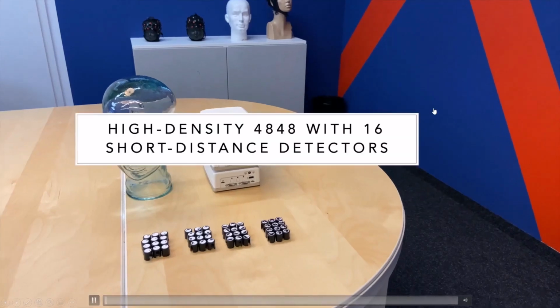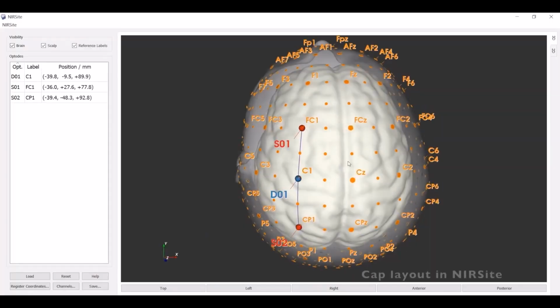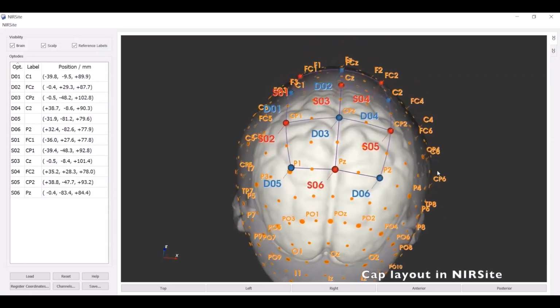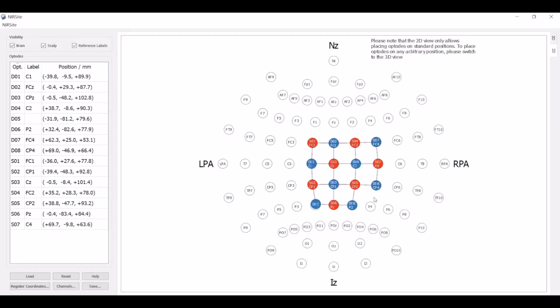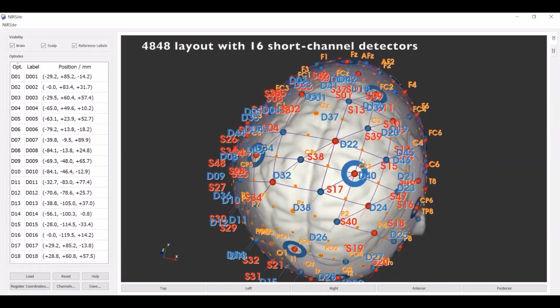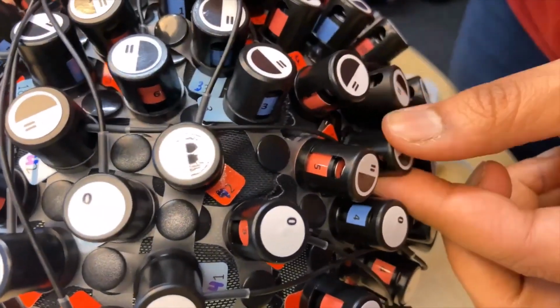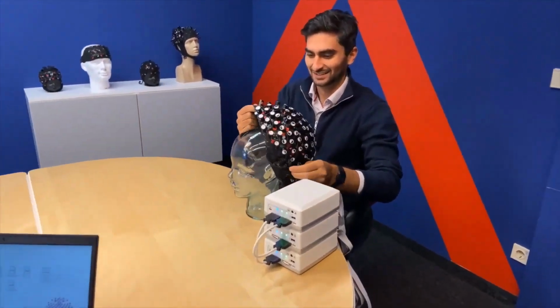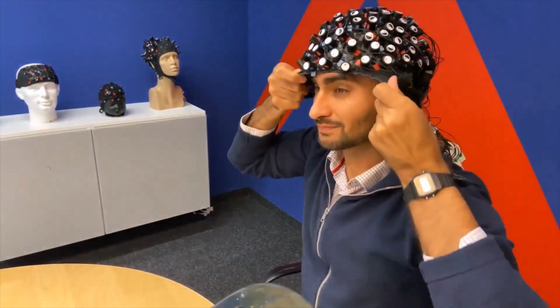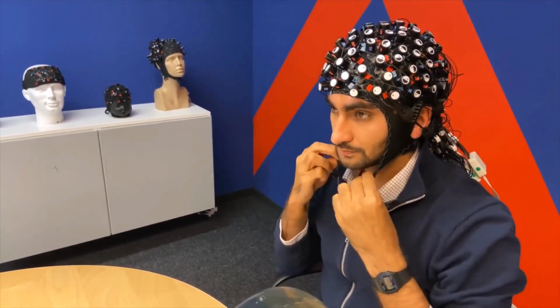Okay, so this is just a short video showing us a very high density measurement, so 48 sources and 48 detectors and 16 short channels, and we'll discuss short channels more later on. But here we're making our montage in NIRSite, so we're placing our sources and detectors in our region of interest on the head in software. We're adding short distance detectors here. And now we have the final layout. So we've got 48 sources, 48 detectors across the head. We've made the montage in the software, then it has to be made in the actual hardware. Here we see the cap being placed on the participant's head. Okay, and this is our NIRSport 2 imaging system, and we'll discuss that more later.